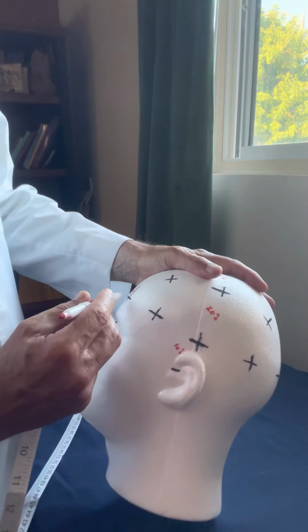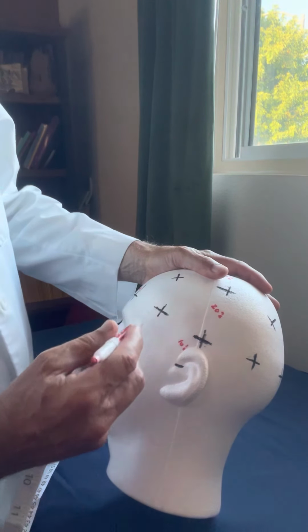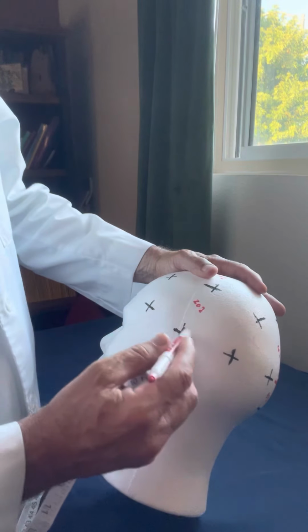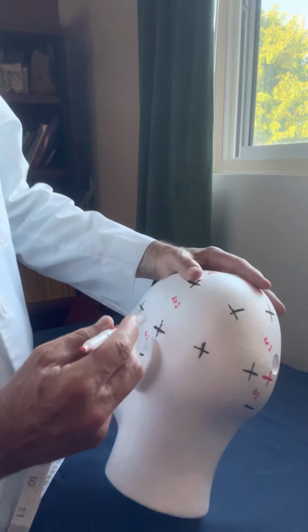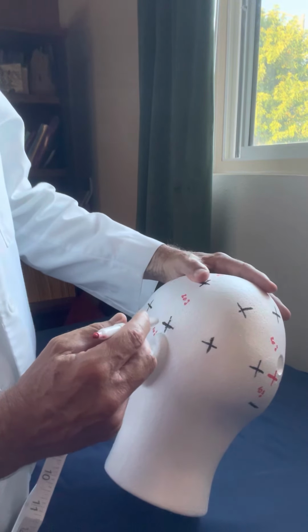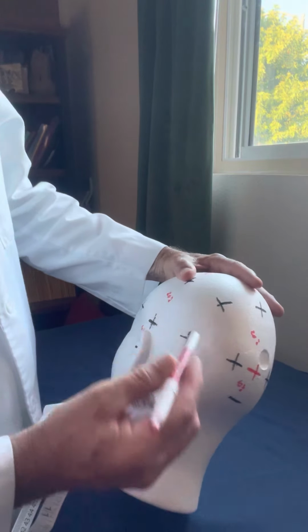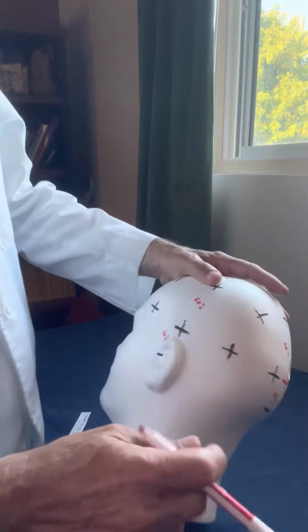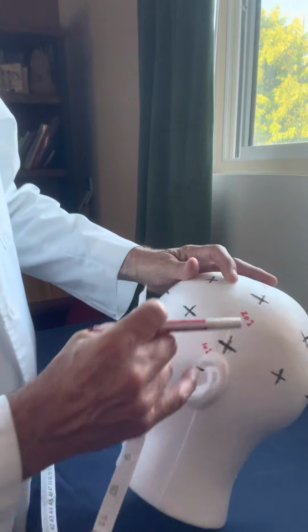Between FP1 and F7 should be 5.5 centimeters, and it should continue on like that. From F7 to T3, it should be 5.5 centimeters. From T3 to T5, it should be 5.5 centimeters. And from T5 to O1, it should be 5.5 centimeters. So let's take a look at that.